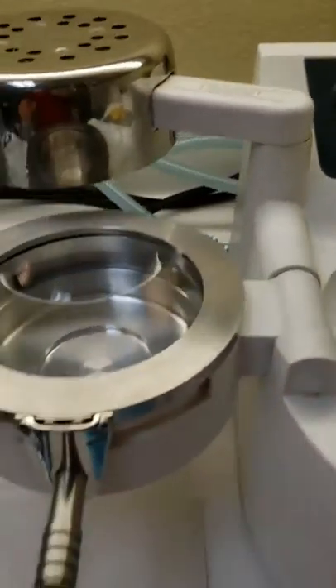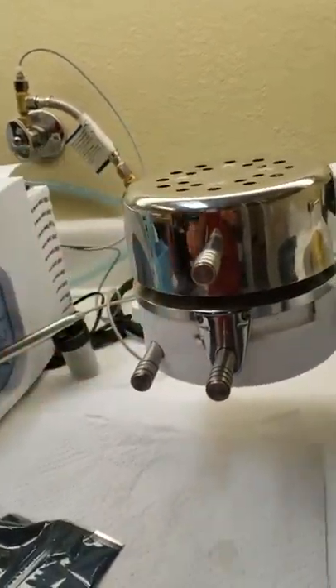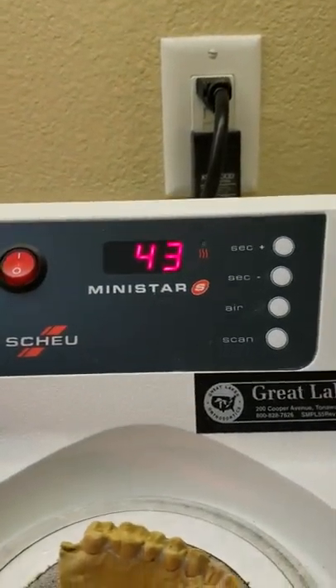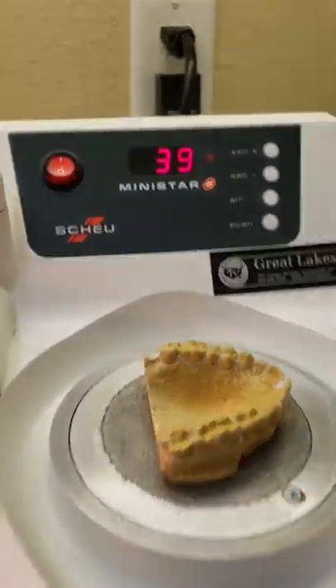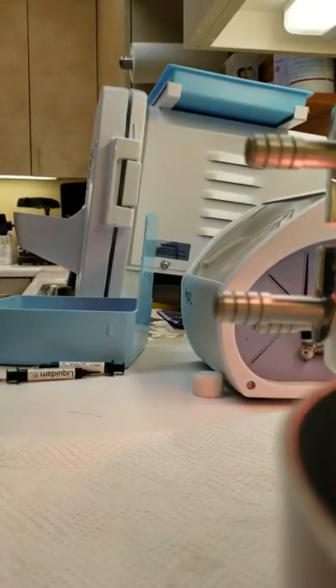The next step is to move the heater — lined up with where the Essex material is so it can start heating up. Once you do that, the timer automatically starts counting down. While that's counting down, come back over and make sure the material bag is sealed all the way.